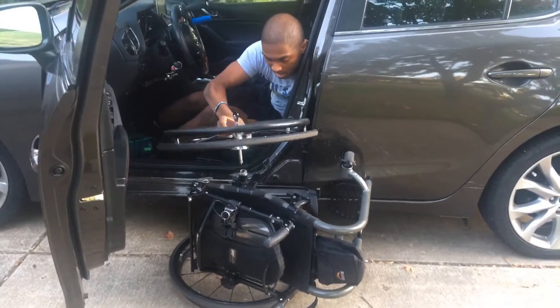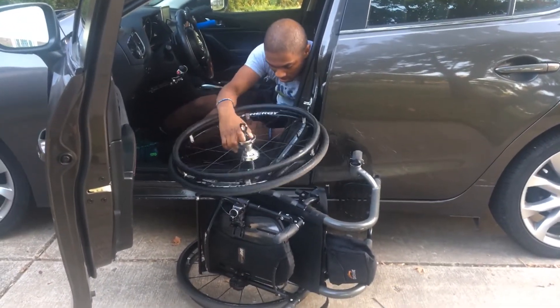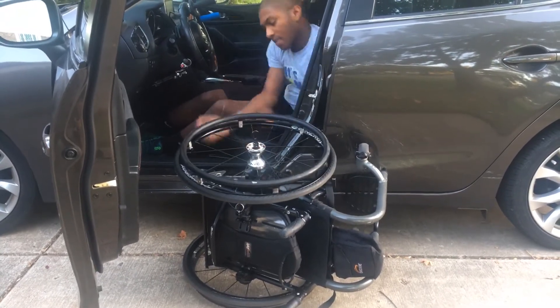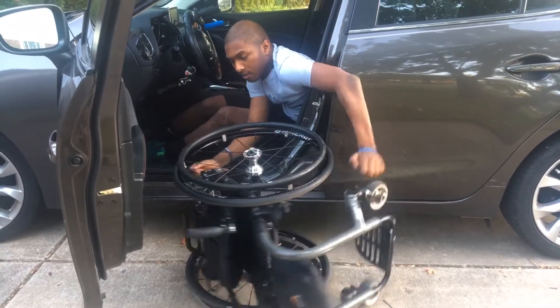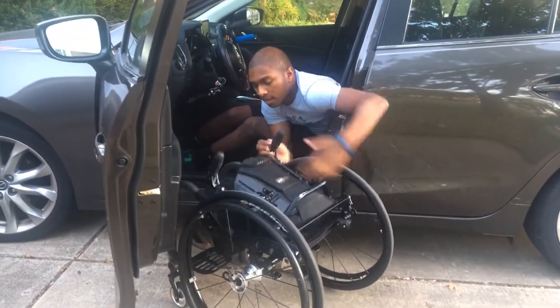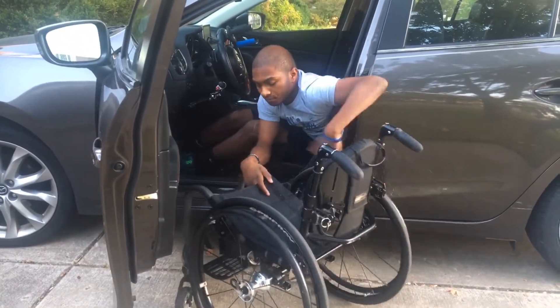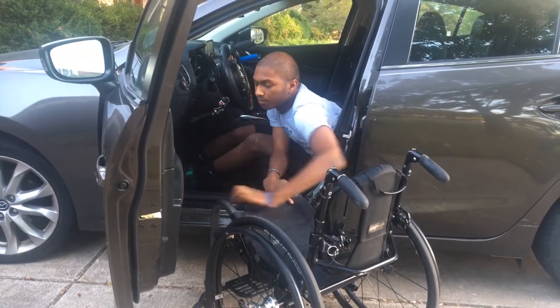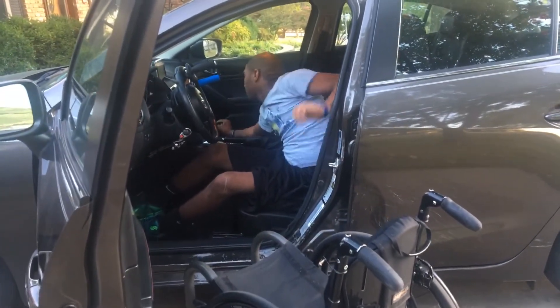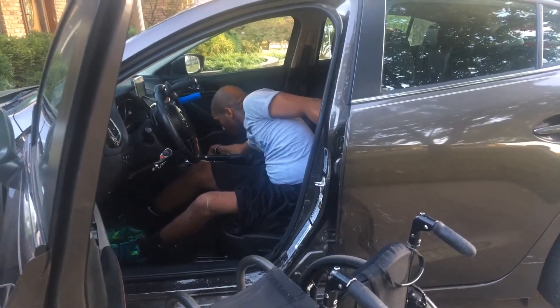Put the axle into the hole — there we go. Put that over — there you go. You've got to lock the chair and grab the seat cover.